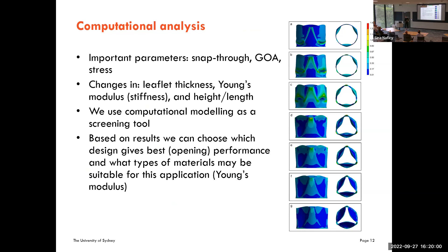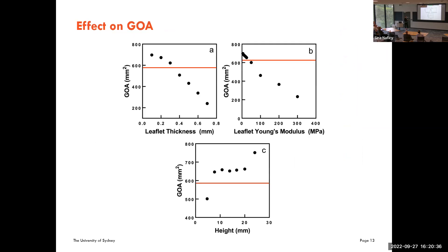This computational study, also included in our recent paper, uses FEA as a screening tool to choose which design gives the best performance. We focused on opening performance and examined key parameters: snap-through, geometric orifice area, and stress. We varied leaflet thickness, Young's modulus, and leaflet height. Increasing leaflet thickness and Young's modulus both decrease the geometric orifice area for the same applied pressure, while increasing leaflet height increases the geometric orifice area.